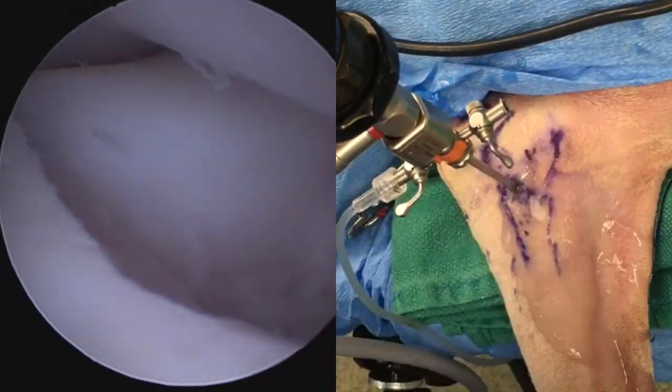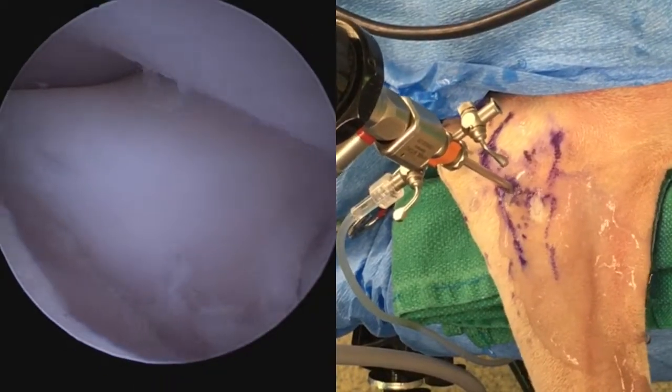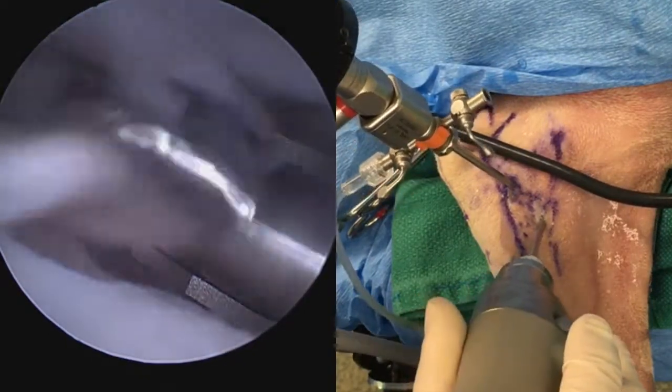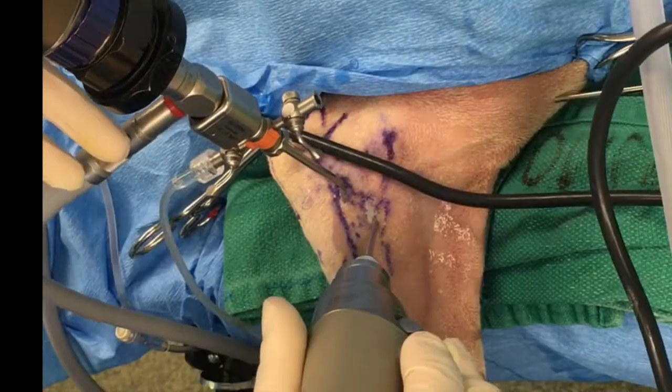The radial head should now be very visible. Pronation and supination can be performed to identify the radial head with a bit more confidence. A shaver is then introduced and we are cleaning out debris with aggressive lavage.